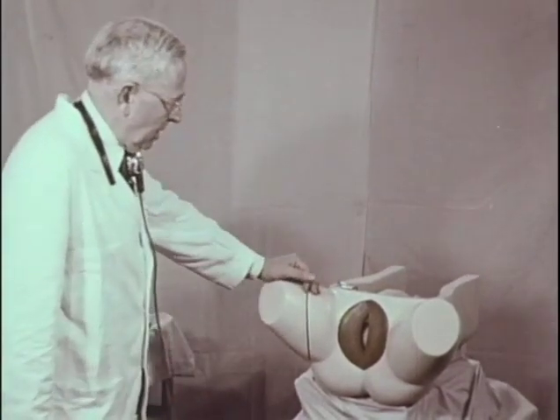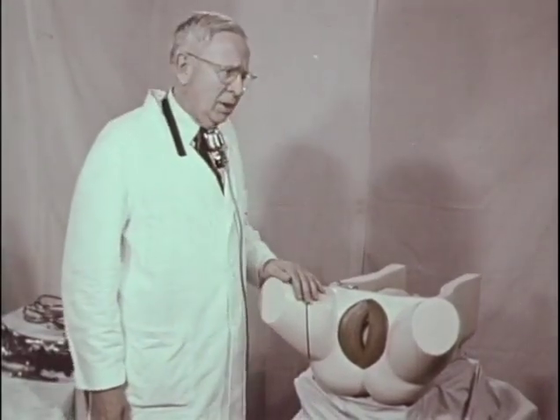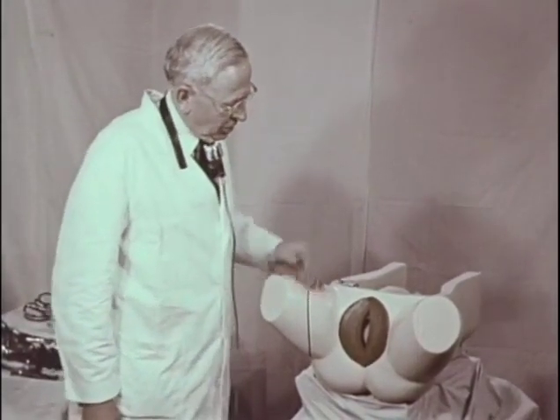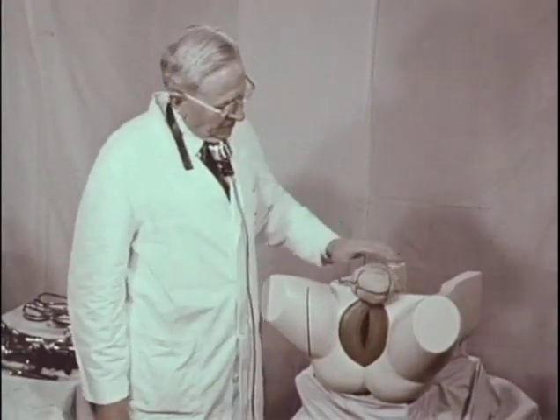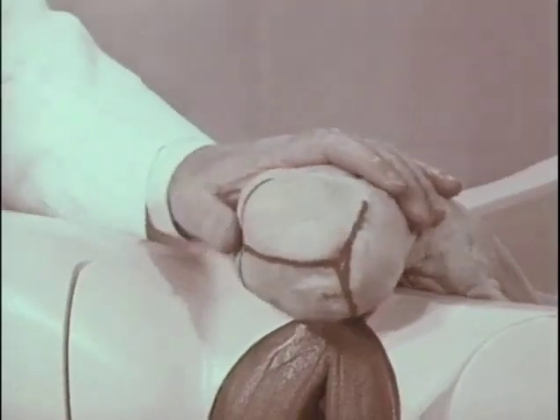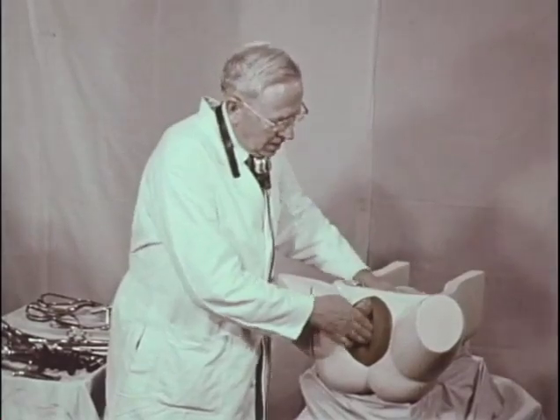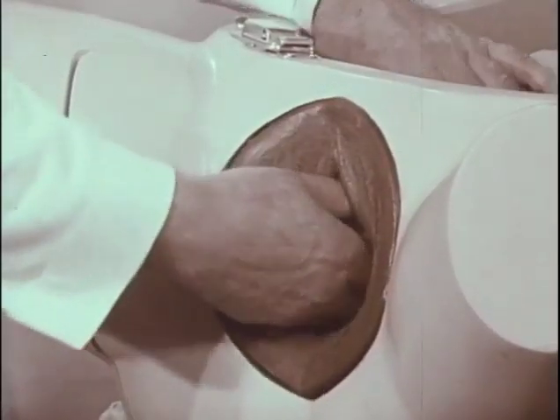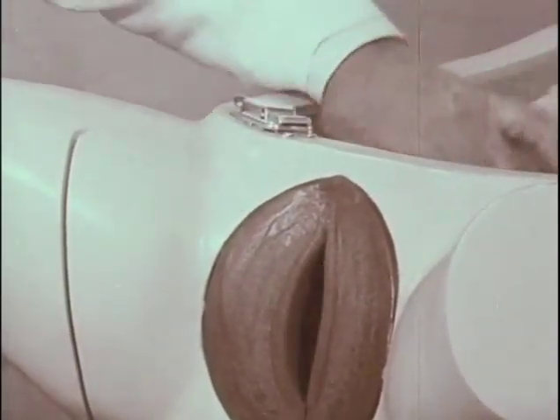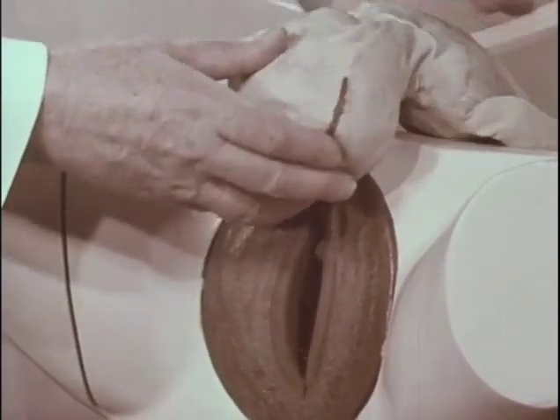First, manual rotation, subdivided into digital and manual. In the digital maneuver, which is desirable to be attempted first because there's less risk of displacement of the head, as would accompany insertion of the entire hand, and we wish to preserve station, because the higher the head, the more difficult and more dangerous the operation.